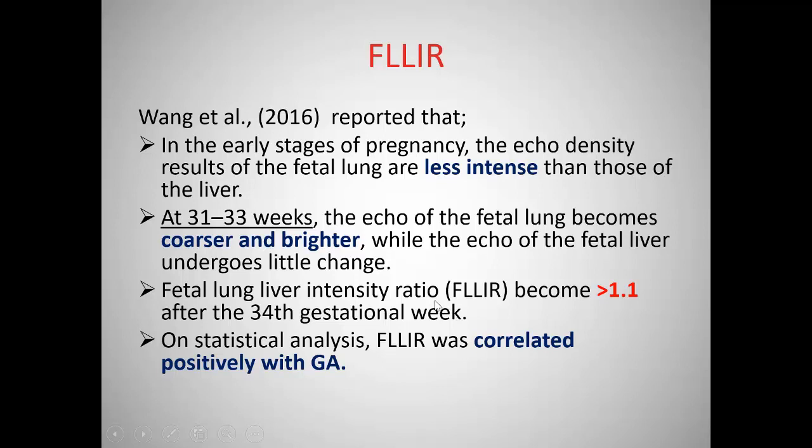Subjectively, I see that the lung is brighter than the liver, but someone may say no, it's so bright that it's nearly the same. So to cut it off, we can do this using a measure.